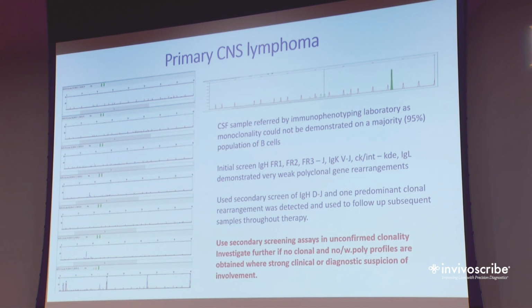Now, there are very few lymphomas that you will find that you can only catch with a D2J. You will usually find they're the early leukemics, but primary central nervous system lymphoma is quite a rare disorder. Okay, so by looking at the mature B cell markers, actually in the patient you knew it was mature, but the fact that you're bringing up nothing would lead you to conclude that, one, they're using rearrangements that don't come up.